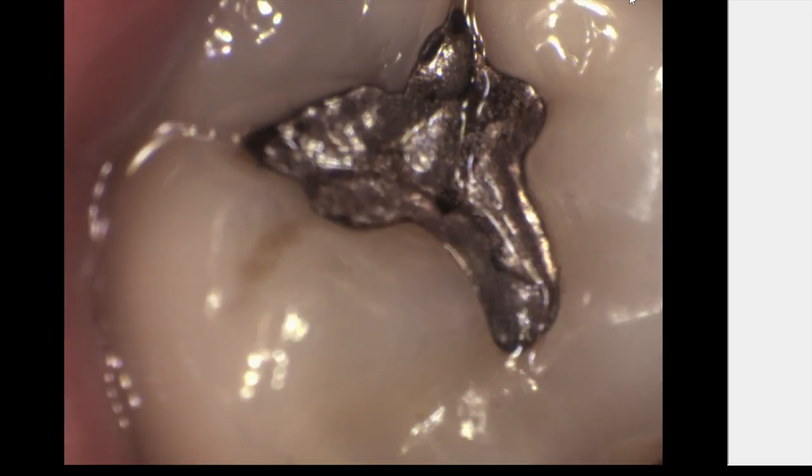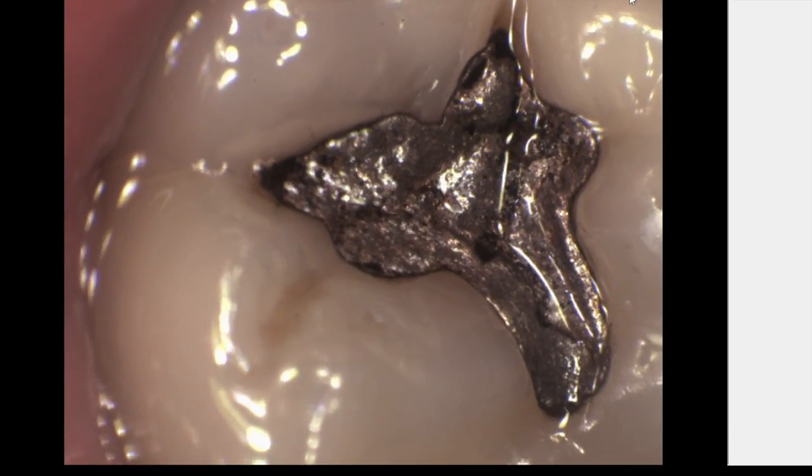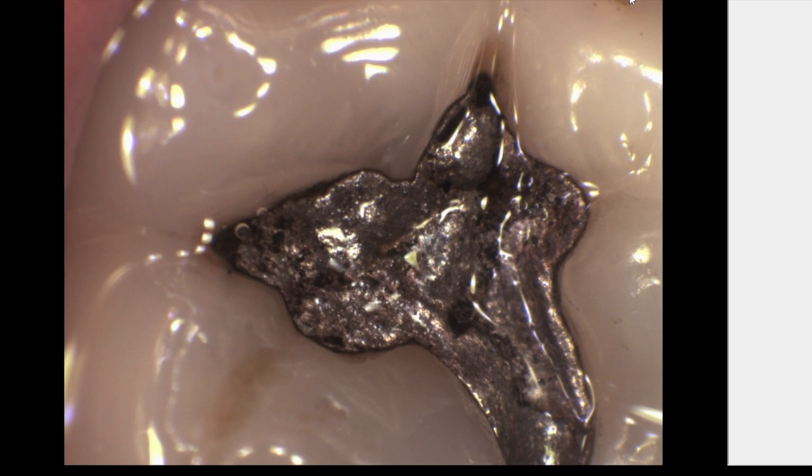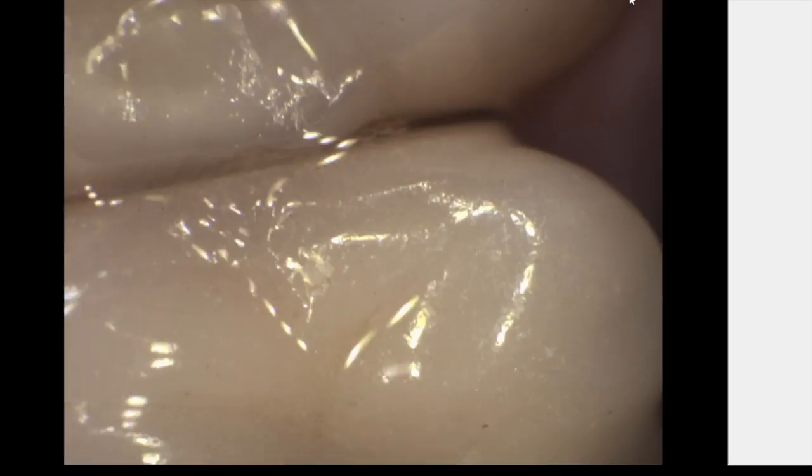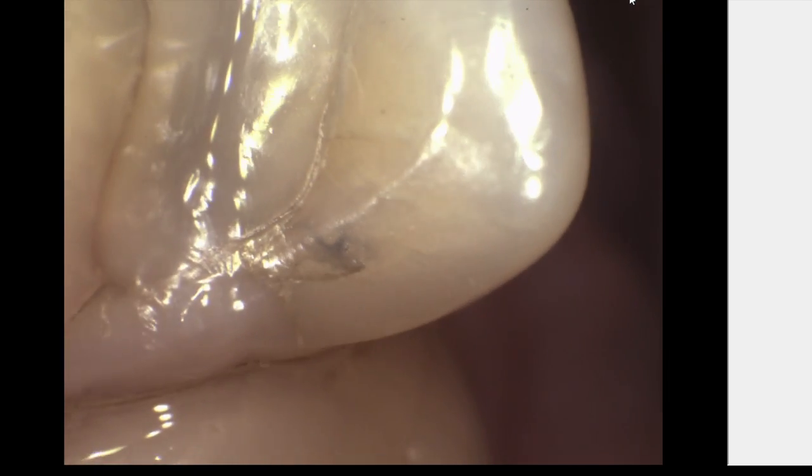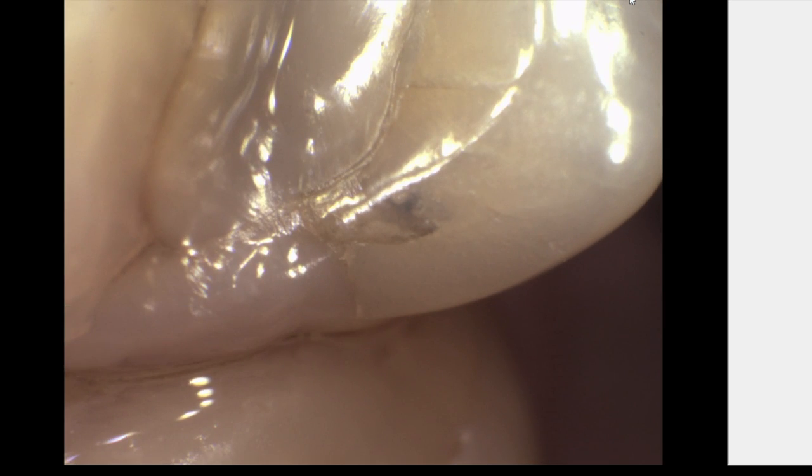And three: it helps cut down on fogging dramatically. Please take a moment to look at this tooth again. Notice how clear and precise the images are, and this is with the camera cover on. But this amalgam looks fairly normal, there doesn't seem to be anything drastic, a little leaking around the margins. We're going to come back to that tooth in just a moment when we use the loom.